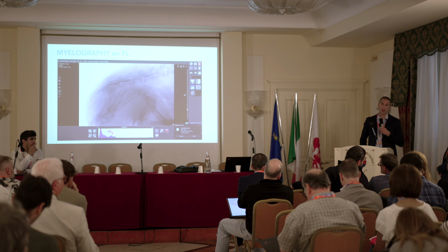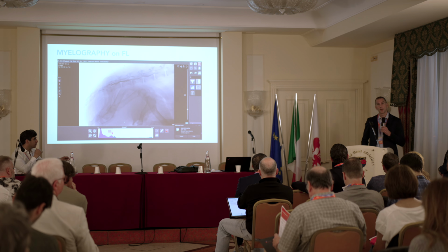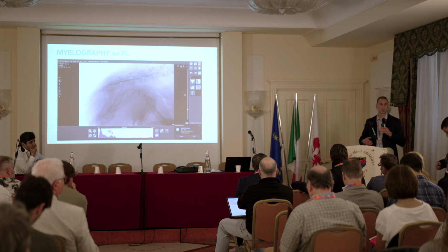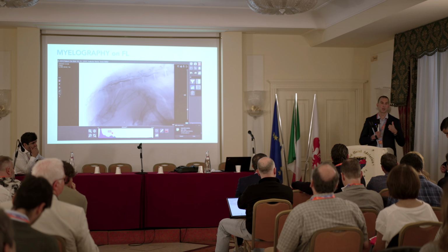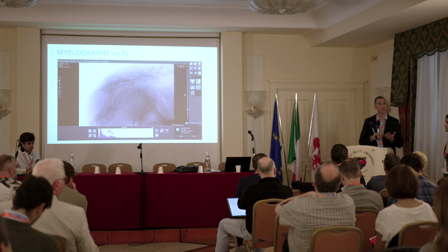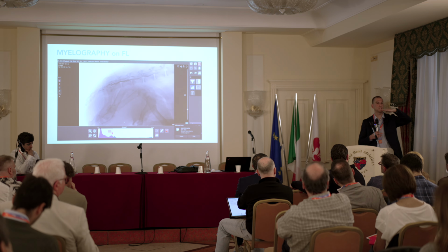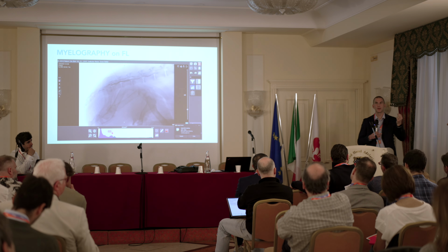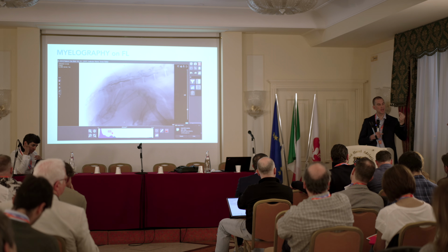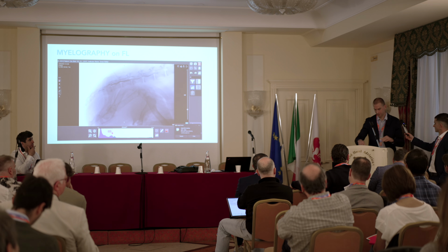So I didn't tell it during the presentation, but here it's a good tip and trick to twist the animal a little bit over some padding, or put the front legs under the abdomen, hind legs under the abdomen. So the spine is not in this position, but in this position, and it's more natural for your hand if you are moving in this direction.